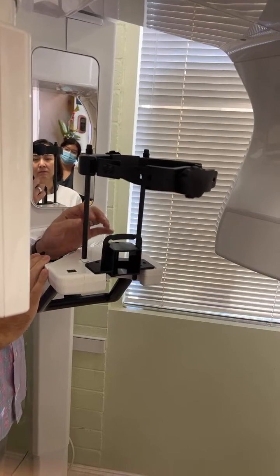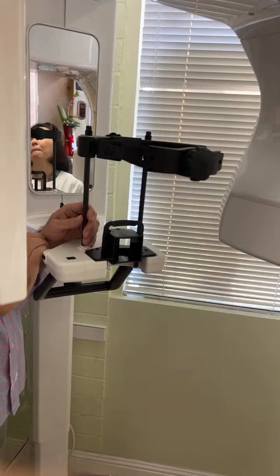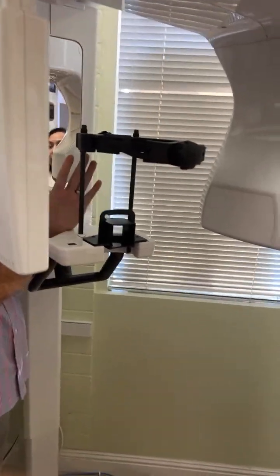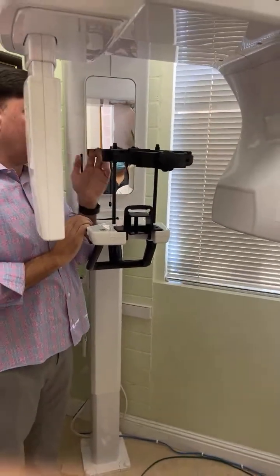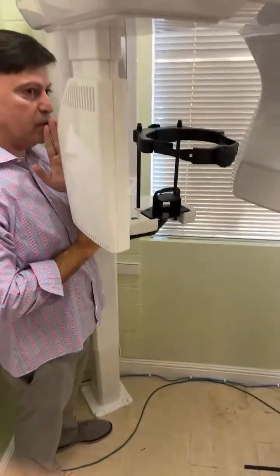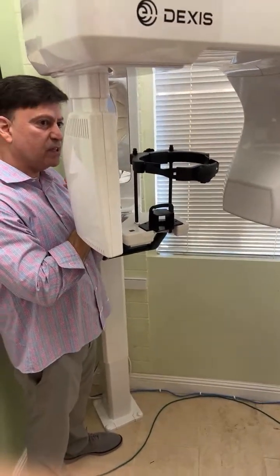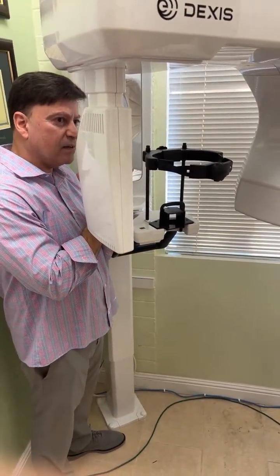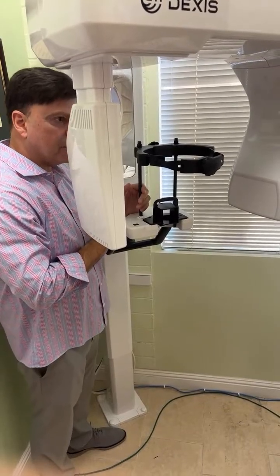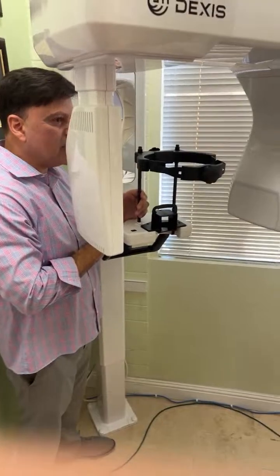A high resolution scan, they really have to stay still. If they don't, you will get ghosting. So let's say you're looking at an implant on tooth number 8, you're looking at the lateral and looking at the facial bone. You'll see a blurriness, like 2 facial bones. And you go, what's going on? Well, the patient moved. And it's very critical with high res. Low res is not as critical.